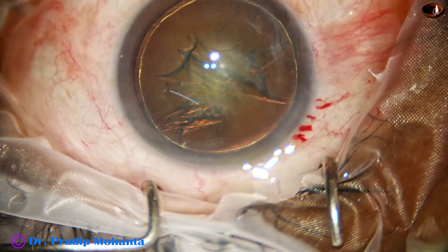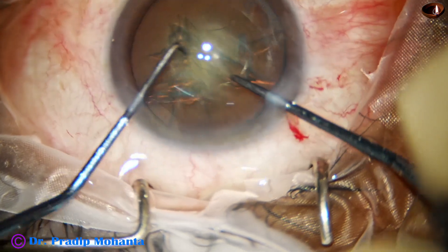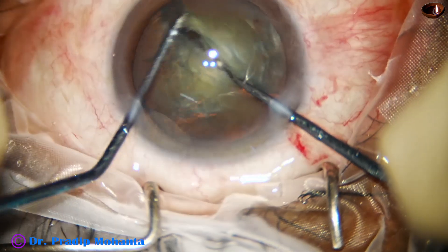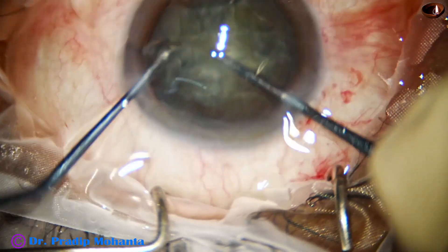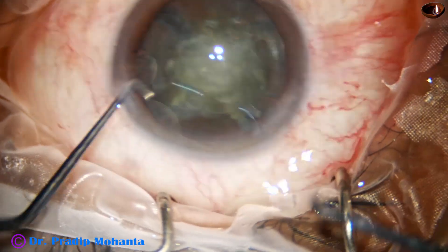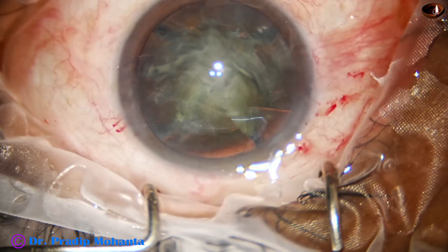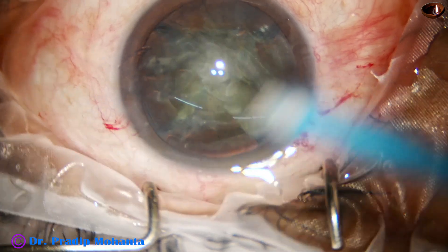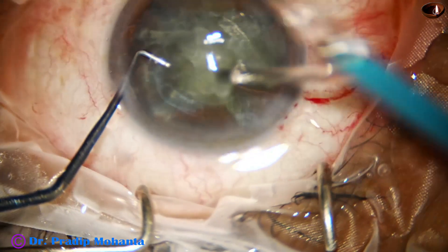Now I am going to pre-chop this nucleus into fragments. The pre-chopper goes through the main wound, the nucleus sustainer hooks the opposite equator, and the two instruments are advanced toward each other. We get a very good cut on the nucleus and divide it into four pieces — the nucleus sustainer helps in cutting.